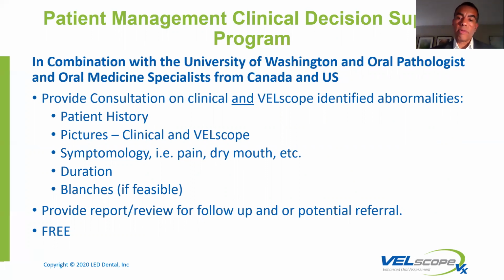And they actually provide a report that provides some guidance as to what they think it could be and the appropriate treatment protocol. So for instance, this is indicative of acid reflux, and therefore a recommendation is get them on an antacid type of medication and then follow up appropriately. So it's very comprehensive in terms of the recommendation, assuming the information that's provided is complete. And that is a service that we provide for you at no cost.